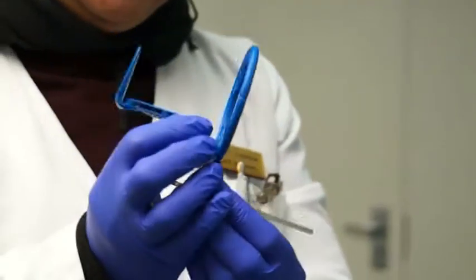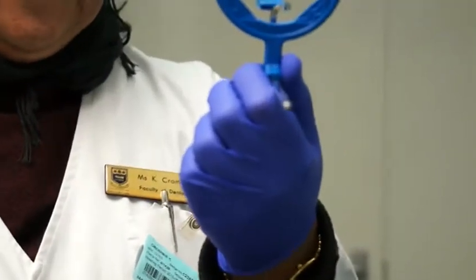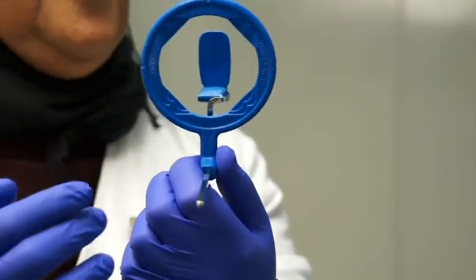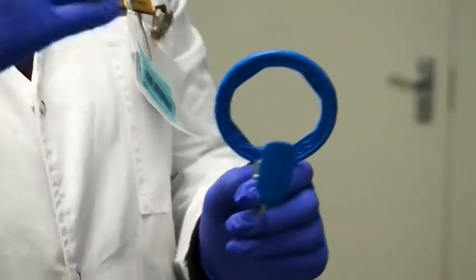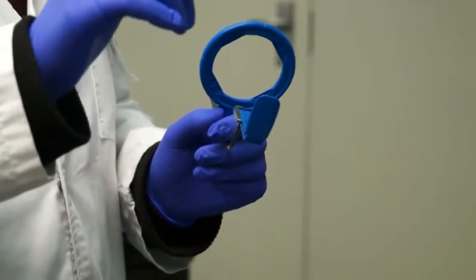Looking at the bite block, it is in the centre, and your cone is going to fit on the locator ring so that you won't cut anything off. Now that I have my ring assembled, I can start with taking my maxillary anteriors.